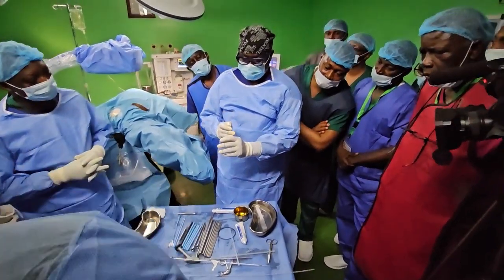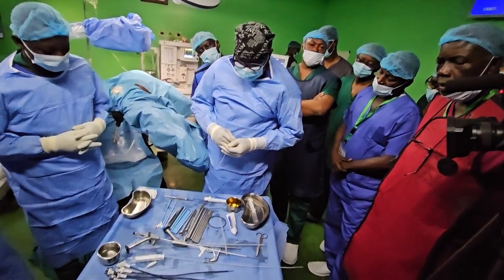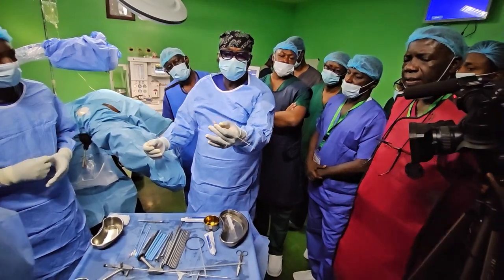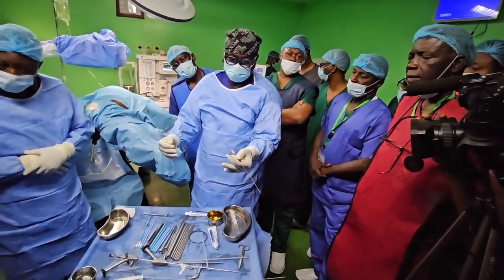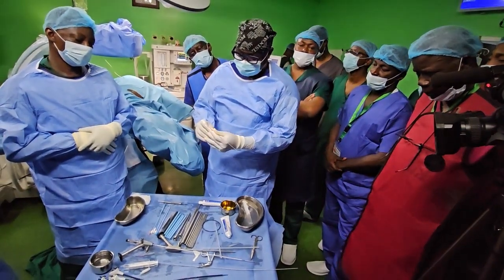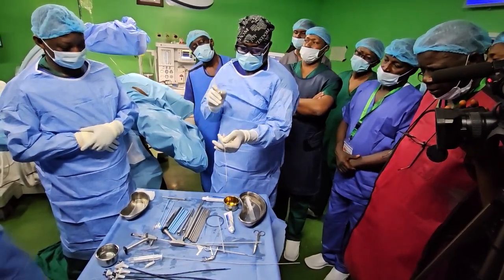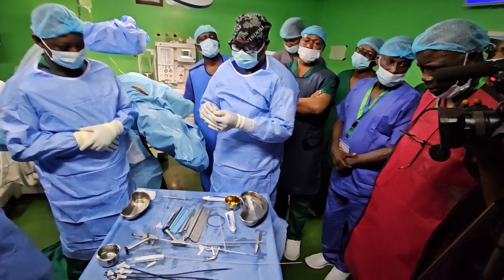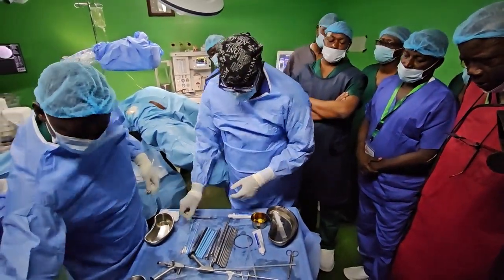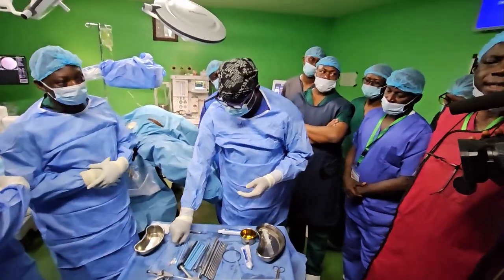Once you are in, how do you know you are in? We'll talk about all that. What makes it 2 parts? Once you remove that, the fluid that you talk about will come out. Yes, the trocar and the cannula. So 2 parts. So this is the puncture needle. Once you are in, you pass our guide wire. My preference is Zebra, again, Zebra 0.038. Do you use any other type? Different people use whatever works for them, but this works for me. The Sensor wire is very good.